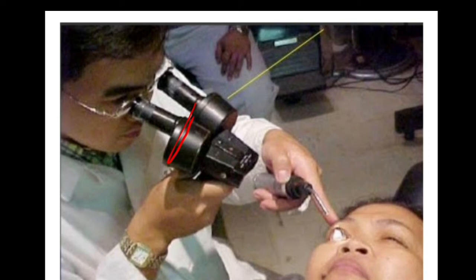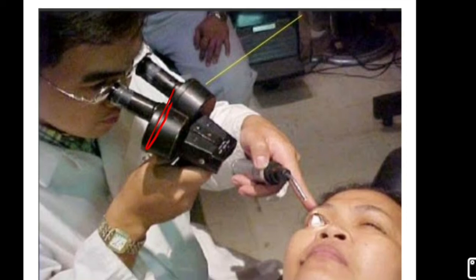It is also useful when you want to examine the fundus through a small pupil using a direct ophthalmoscope. This can be used in surgical treatment of infantile glaucoma as well. So these are the advantages of direct gonioscope.